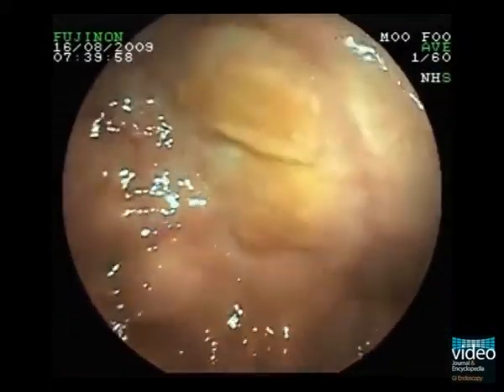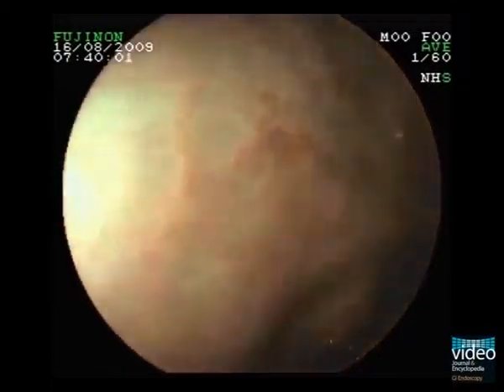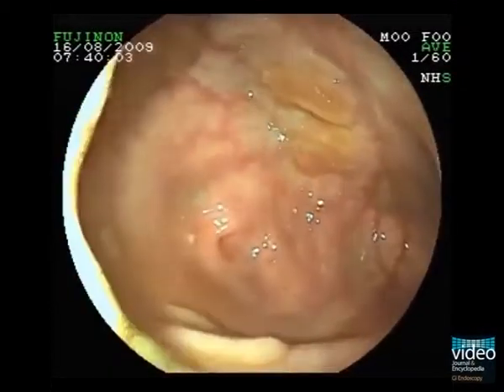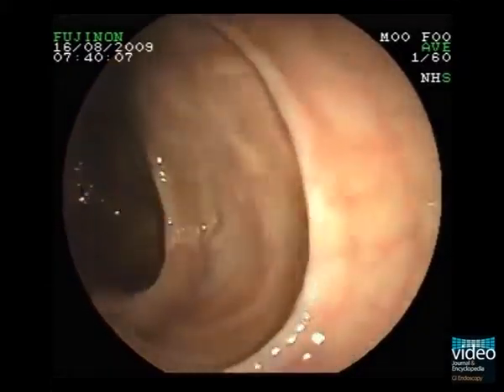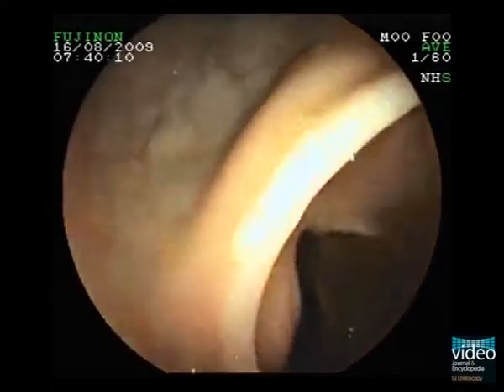This is another patient with hyperplastic polyposis. In the cecum, we see this typical flat yellowish lesion that looks like bile stained. These lesions have the characteristic appearance of sessile serrated adenoma.